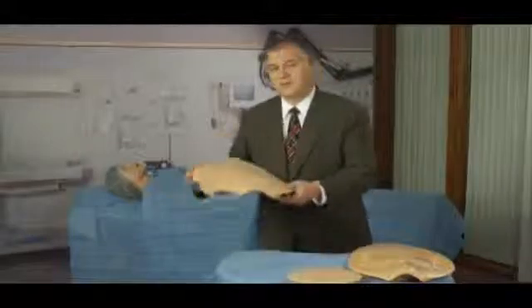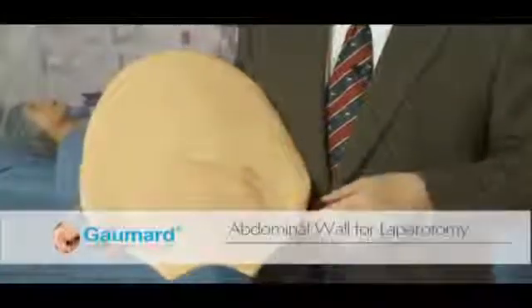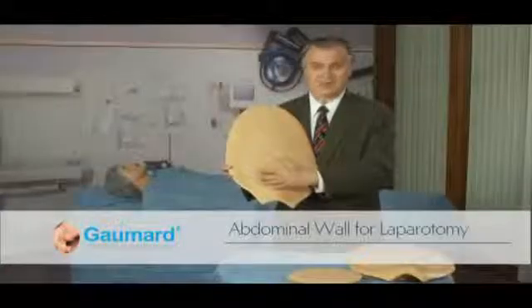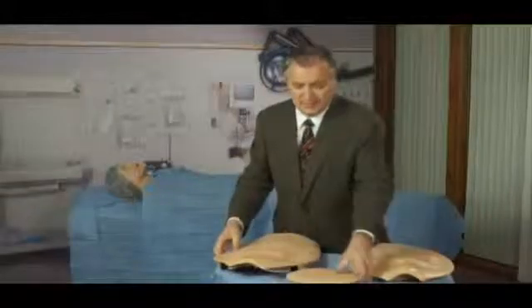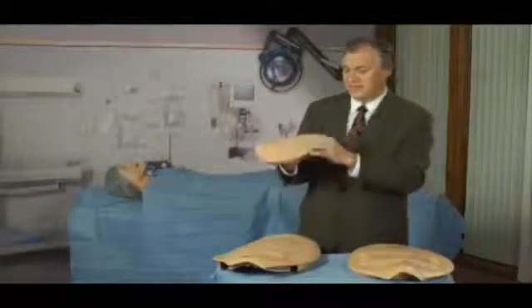This part is called the abdominal wall. This is the laparotomy abdominal wall. Within the laparotomy abdominal wall is the abdominal insert, which is the part that's actually going to be cut during a laparotomy. Let's take a look at the abdominal insert.